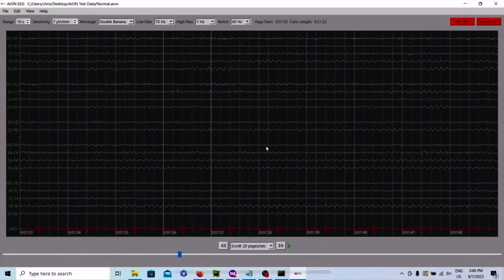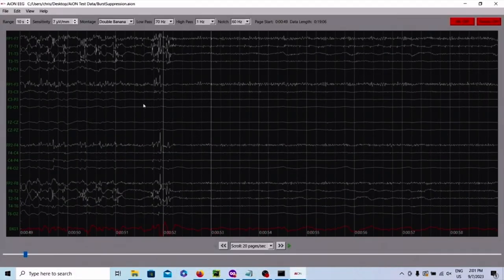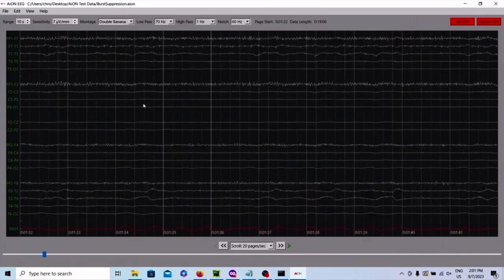First, is it continuous? The best example of that is a normal EEG — I'll show you that here. Very continuous, it's happening without stopping. The best example of a discontinuous EEG — an extreme example — would be a burst suppression pattern, where you have little bursts of activity and then a big flat line in between, and then a burst of activity again. So that is discontinuous, and a normal EEG is continuous. That's the first thing to take note of.